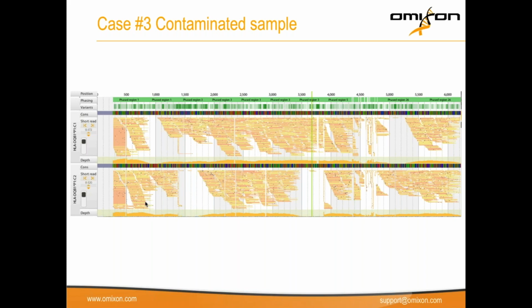What we see here is that the short reads are not overlapping to form a continuous consensus sequence. There are big gaps throughout the consensus, and also there are some isolated read blocks that are entirely dissociated from the rest of the sequence. This effect shows that the algorithms had a lot of trouble constructing accurate consensus sequences.